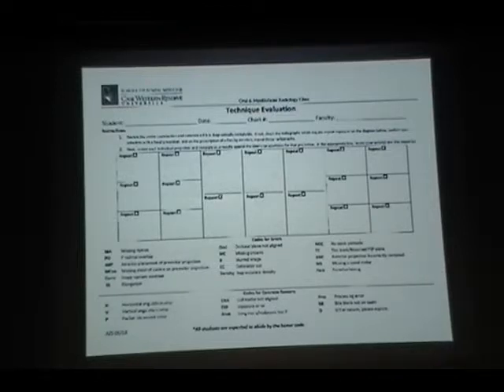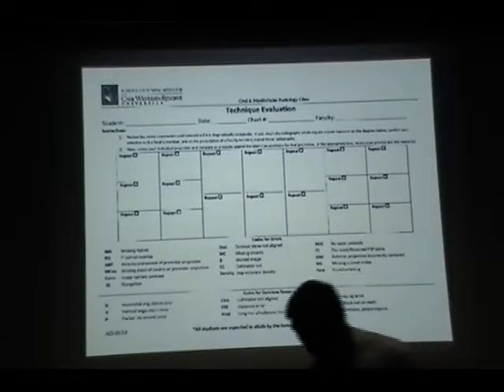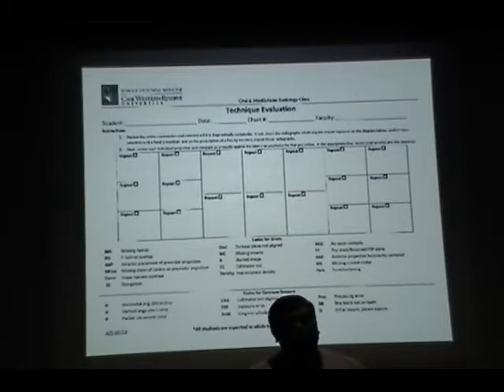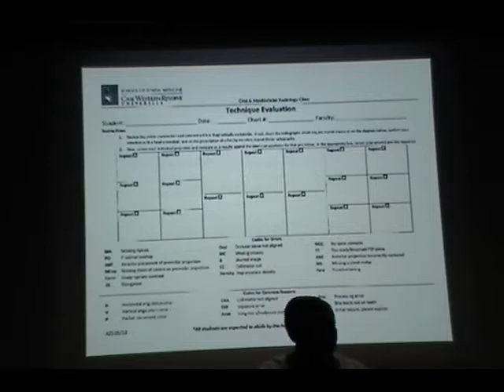That means if you're taking a full mouth series, let me give you a scenario. A patient who is relatively young, maybe 18, 20 years of age, no high risk caries, no periodontal disease. After you check, you obtain only the bite wings and a panoramic radiograph. In that scenario, you are allowed to take bite wings, 4 plus 2 more retakes. Make sense?